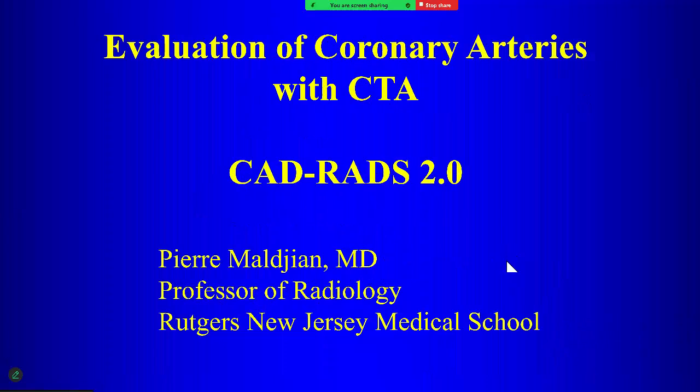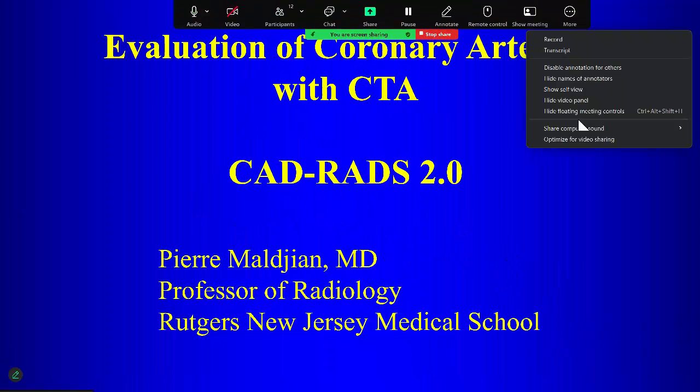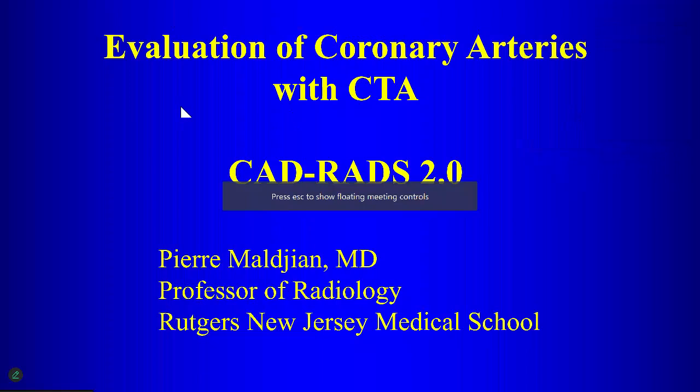Okay, so what I want to talk about is how we actually approach interpreting these coronary studies for stenosis and otherwise. And so there is a scoring system for this, and it's called CAD RADS, and the newest version of this is CAD RADS 2.